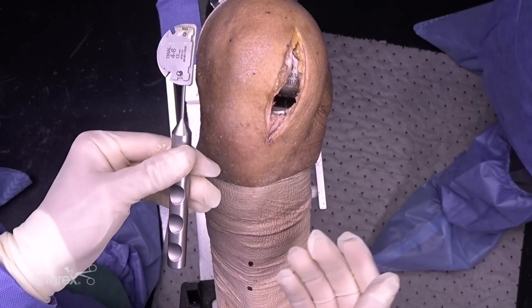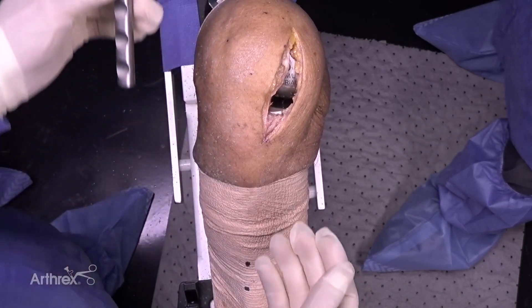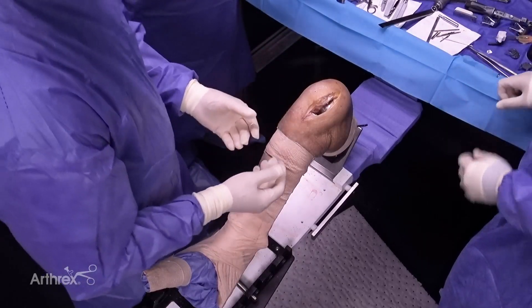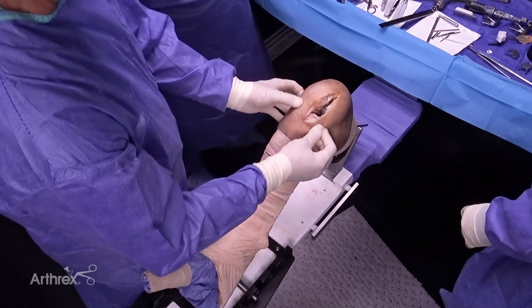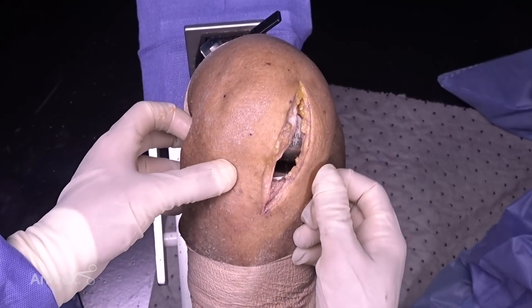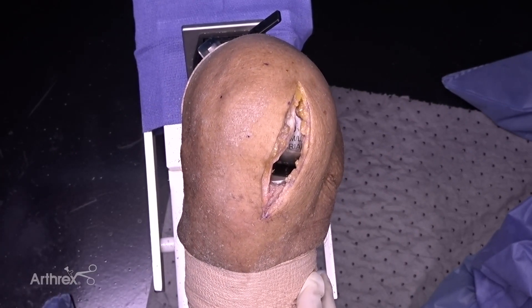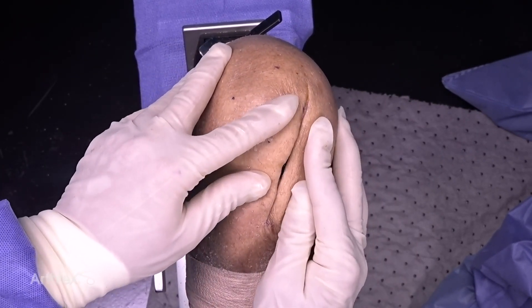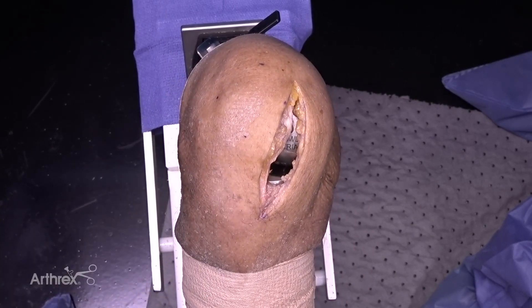Once this is done, you put in your real polyethylene. Once the real polyethylene is in, we use pulse lavage to copiously irrigate the area. We close the retinacular opening — my choice being O-Vicryl. We use 3-O subcuticular monocryl under the skin. I use staples, though some people will use skin glue — either one is fine.